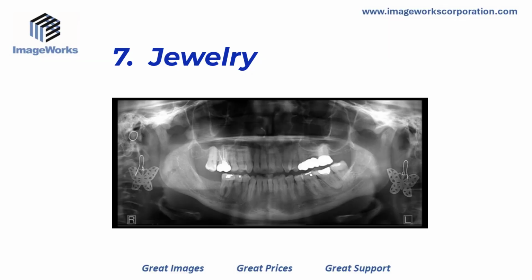While most operators understand that jewelry should be removed, sometimes it's not understood how much an earring can ruin the entire panoramic radiograph. This is because each earring will show up twice, once clearly in the expected location, but then again as a projection, or ghost artifact, typically in the upper posterior. It is the projection artifact that may not be as obvious, but it can be damaging to the diagnostic value of the radiograph.